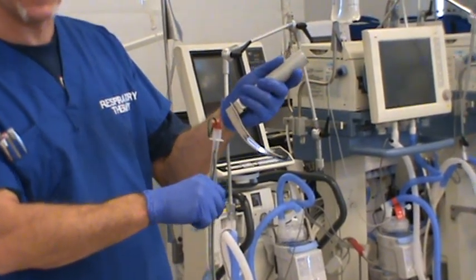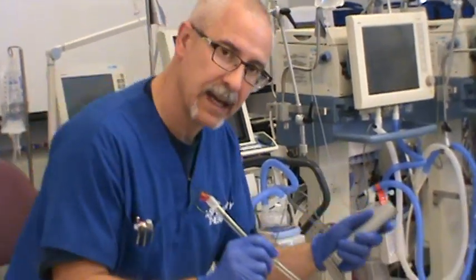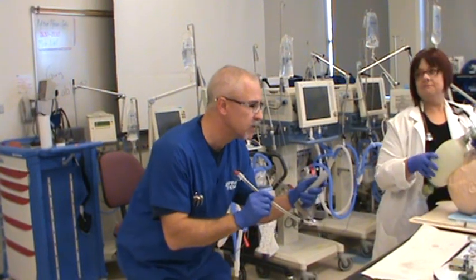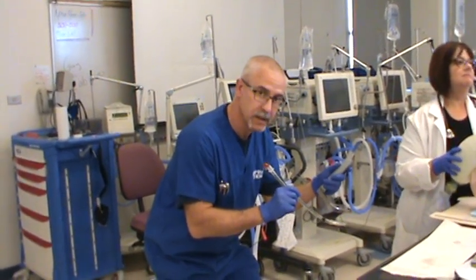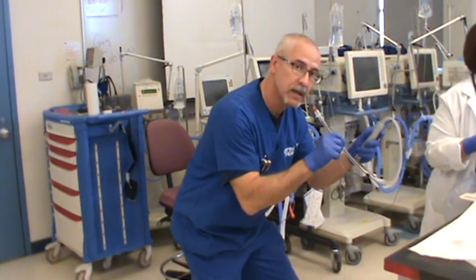I want to avoid using the top teeth as a leverage point to visualize, because I want to keep the bottom teeth clear of my laryngoscope. The position I typically get in — I crouch a bit, put my right foot behind my left foot, give myself a nice straight back, and I usually use my legs a lot to help lift up the airway and to insert the tube into the patient. This gives me a good ergonomic position and a lot of strength to get the tube in.